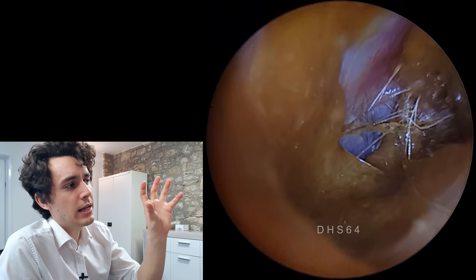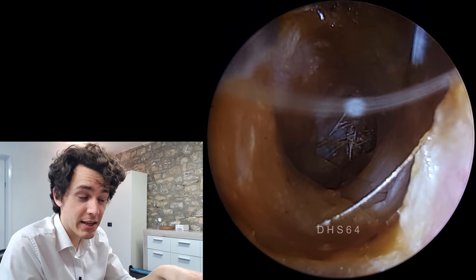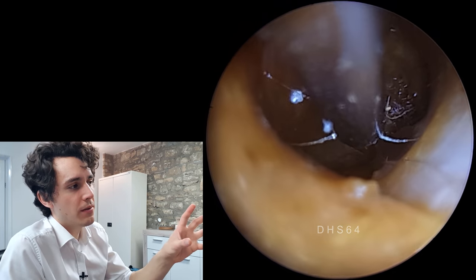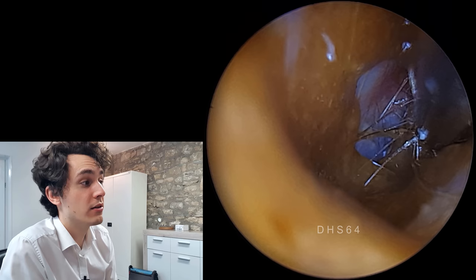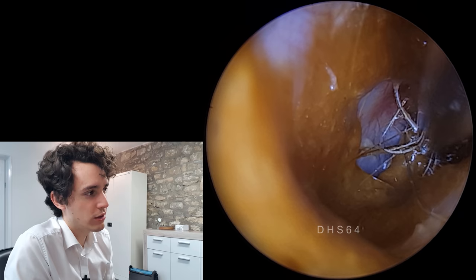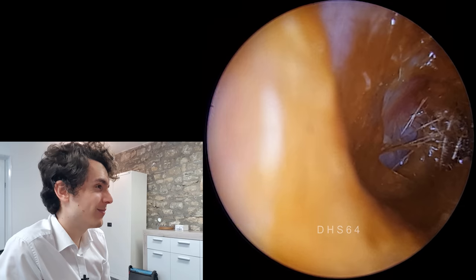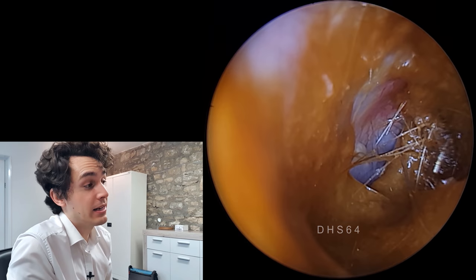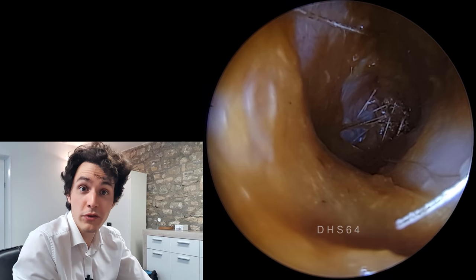We very rarely talk about it, but in this particular case you can see there's lots of wax very deep in the ear canal embedded with hair, so it's a quite difficult case. At certain times during this procedure the patient would not stay still — he would fidget uncontrollably at certain times. So if you ever see the camera move around and shake like a little earthquake, that's a sign the patient is fidgeting. This makes microsuction a bit dangerous, particularly if you're trying to do work near the eardrum.